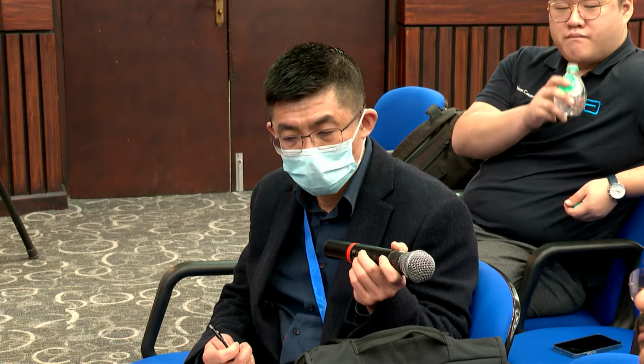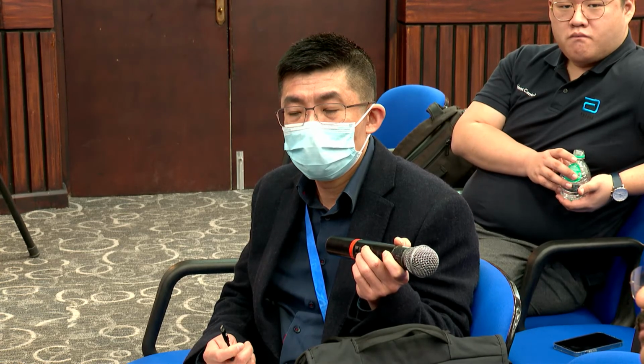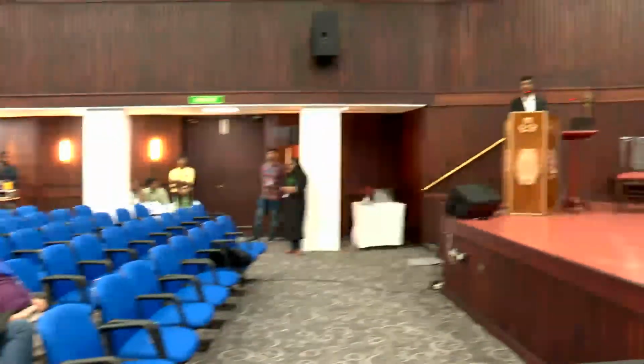Yeah, there are two things here. One, how we define acute success on table. The way we define success for His bundle pacing at the moment is at 1 millisecond and 2.5 volts. The acceptable parameters could very well be much less than that. What I mean is, with 2.5 volts, we accept some lead output, say 1.5 as a threshold at 1 millisecond. There were 3 patients who had failed, who had a threshold of around 2 at pacing, and we could accept it, and all of them were parahisian.